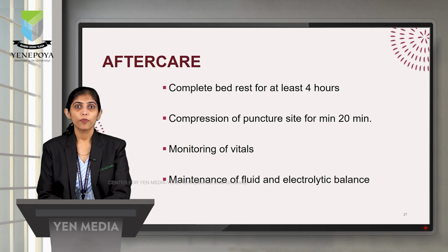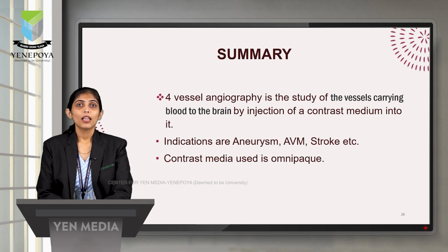So summarizing, this is a procedure which is used to see the blood vessels which carry blood to the brain by injecting contrast media into it. The indications could be aneurysm, AVM, stroke, AV fistula, and the contrast media which we use is Omnipaque.